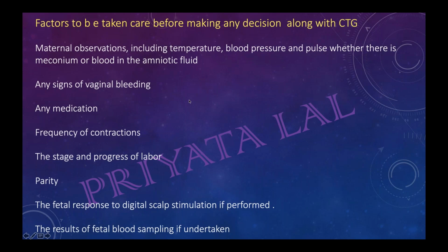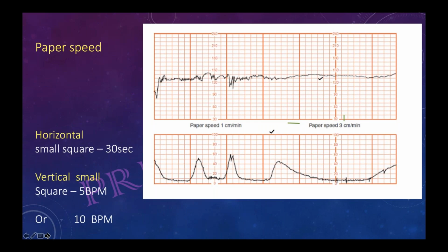This part you need not remember. It is just to understand that whenever you answer a question, it is combined: general findings of the mother, abdominal findings, vaginal findings, and CTG. So we have to take everything into account. Okay, so this was a bit of theory.